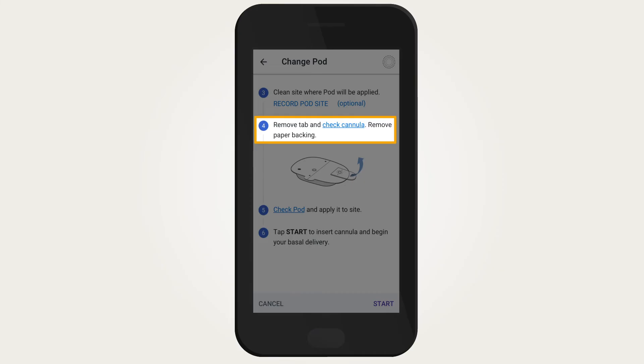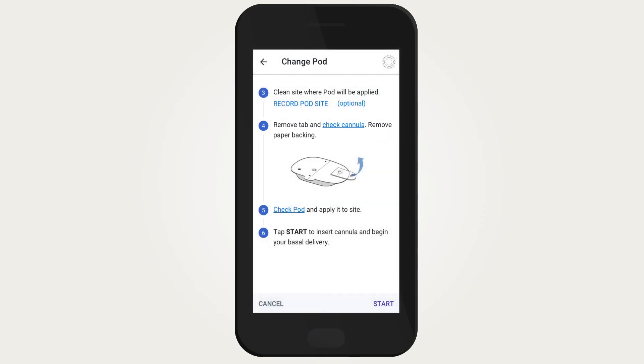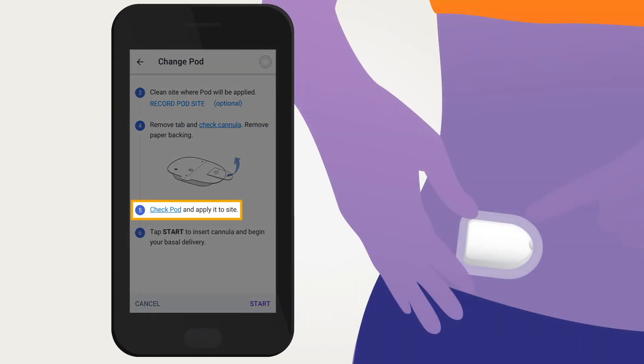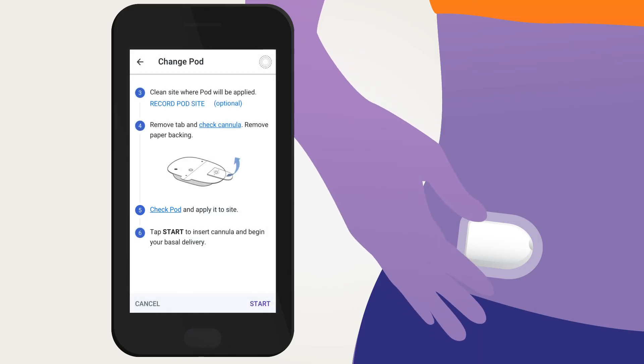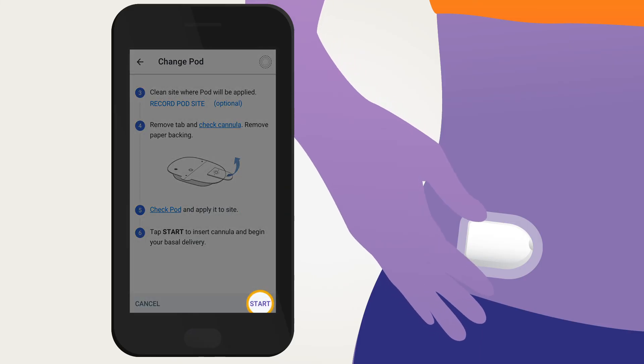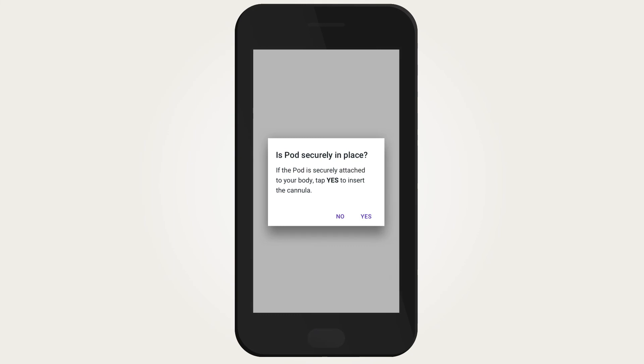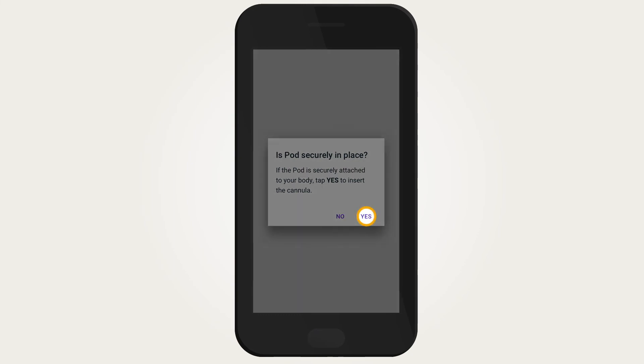Remove the pod needle tab and confirm that the cannula is not sticking out. Remove the white paper backing and make sure the adhesive is clean and intact. Apply the pod to the selected site and run your fingers around the adhesive to secure it. If the pod was applied to a lean area, gently lift the skin around the pod. Tap 'Start' to insert the cannula and begin basal delivery.